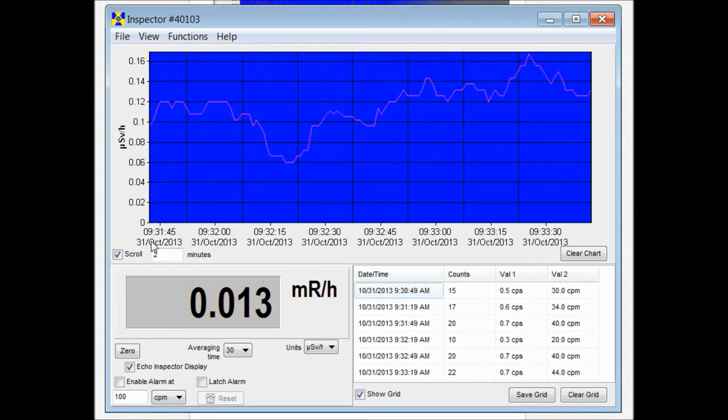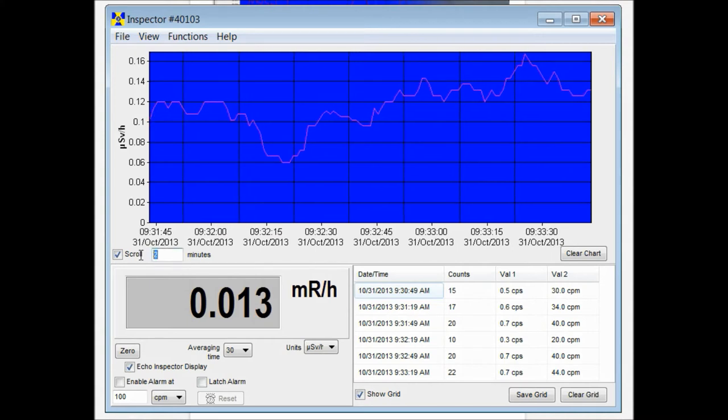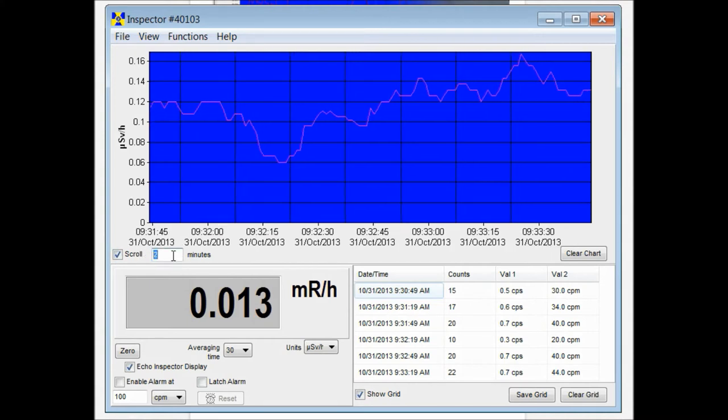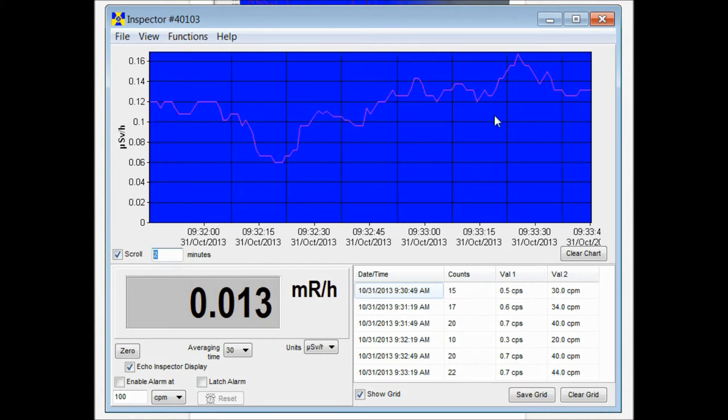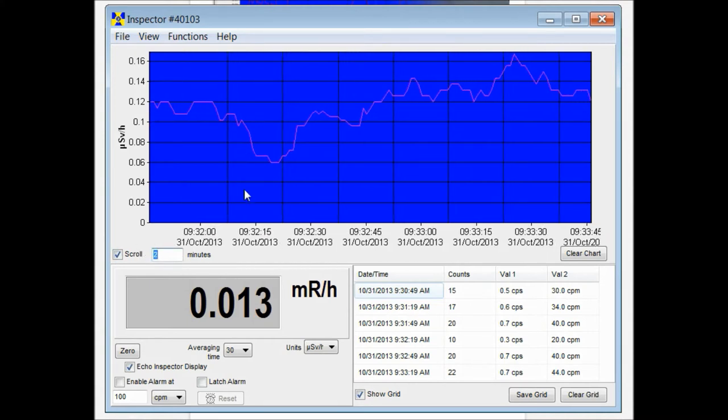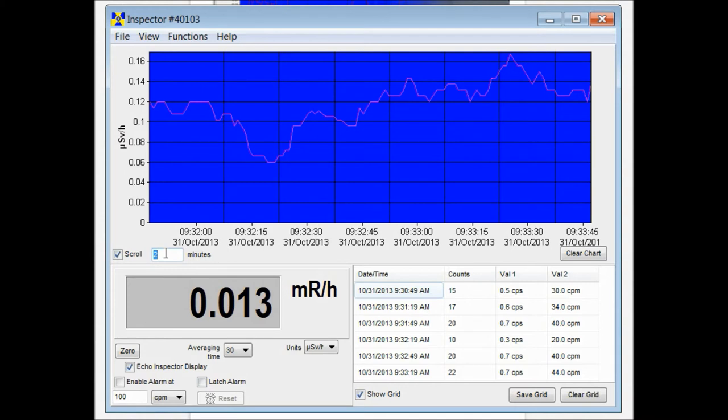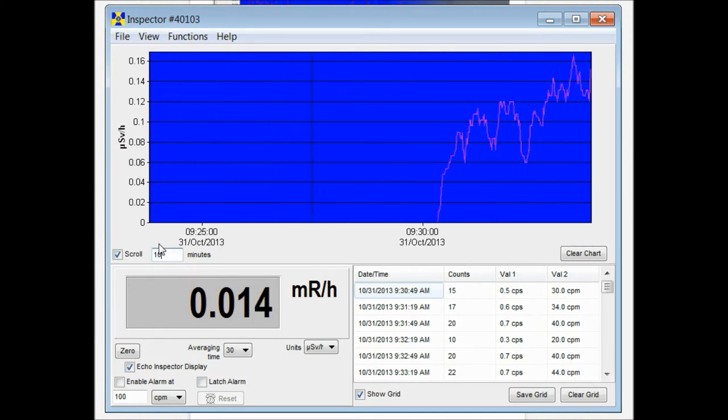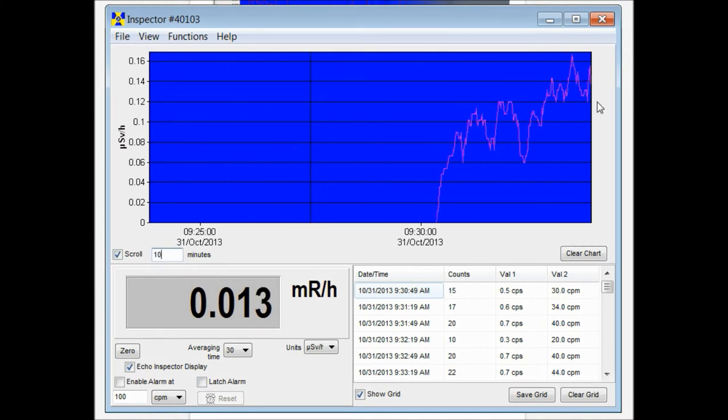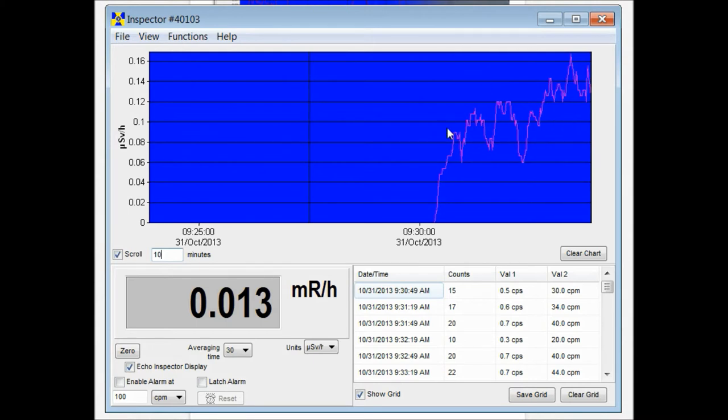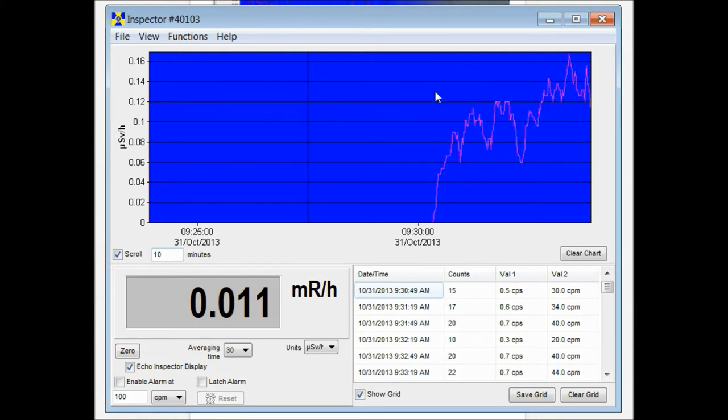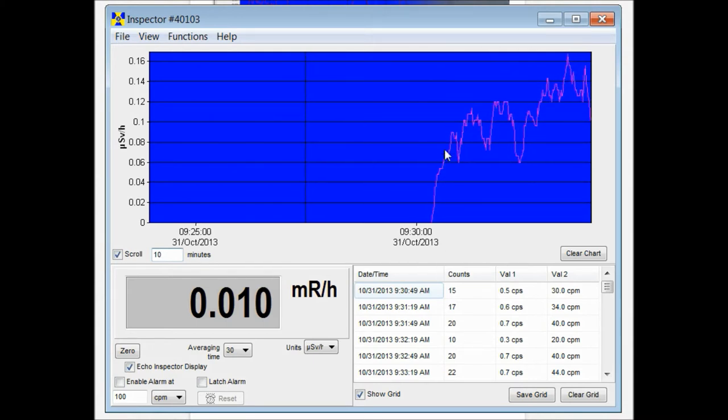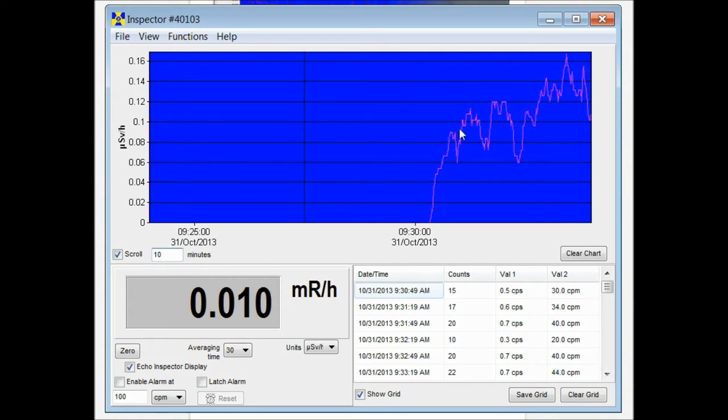If we want to see more of that, we can change the scroll window to say ten minutes. Now we're seeing a ten minute window in our time. Now we haven't had the unit plugged in for ten minutes, so this is where we plugged it in and this is where it started collecting data.